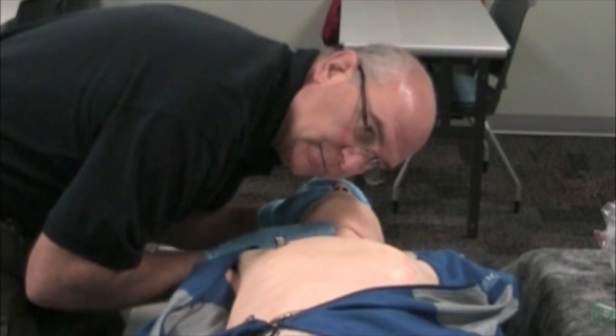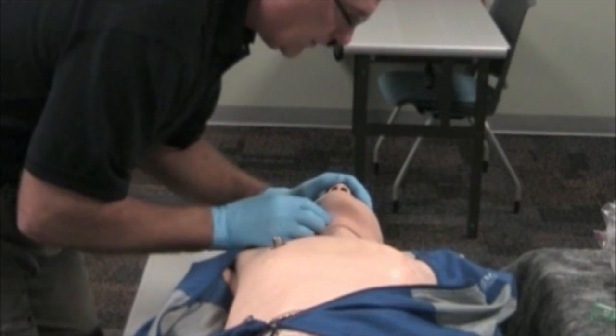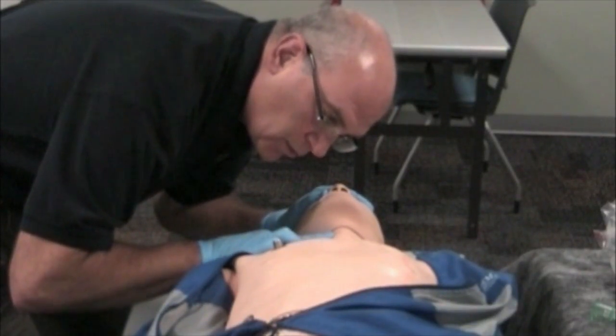We look, listen, and feel. The patient is unresponsive and apneic. At this point I would request ALS assistance, and I will check a pulse. You palpate a weak carotid pulse at a rate of 60.